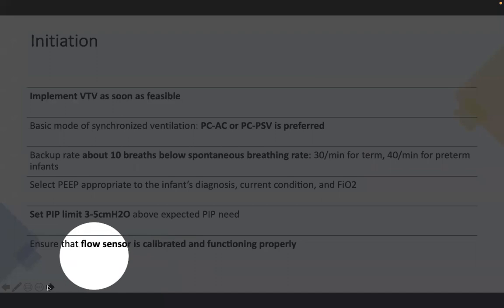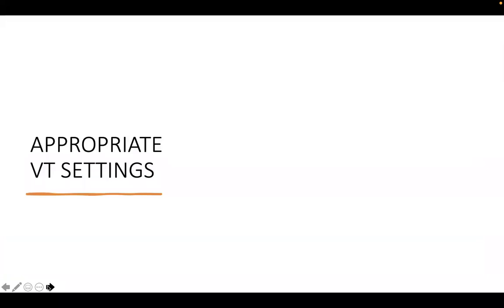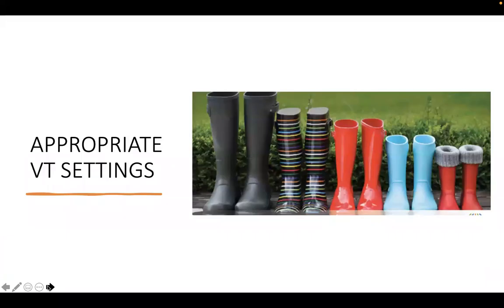This is very important. If the flow sensor is not working, it means that the VG is not working and we are not doing the correcting. Coming to the appropriate tidal volume settings, we should remember that setting a particular tidal volume is not suitable for all infants. Just like one size does not fit all, as popularly narrated by Martin Keszler. So we should set the VT according to the condition of the group.